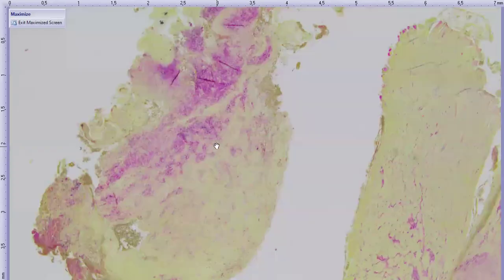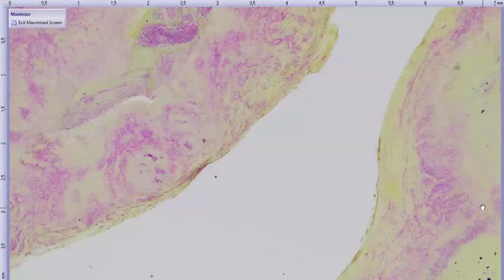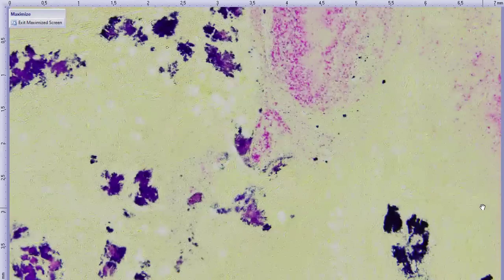botryo refers to grape-like, and mycosis refers to fungus, but actually it's a misnomer, like many in medicine in general. But anyway, here's the gram stain of this case of the orbital tissues. You can see all of these are the pyogranulomas. And here are some clusters of grape-like bacterial colonies. This very, very dark color means that they are staining positively with the gram stain. They're gram positive, and that fits nicely into our thoughts about this being some sort of staphylococcus.